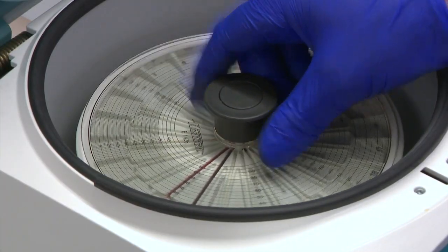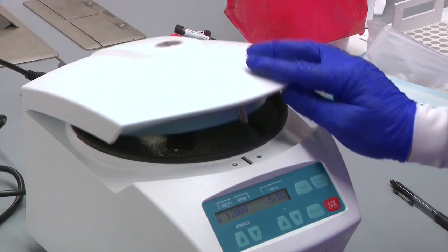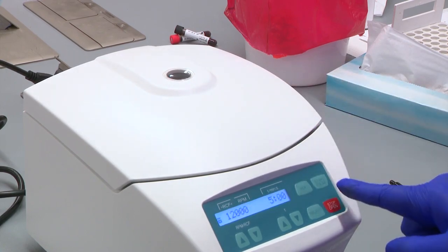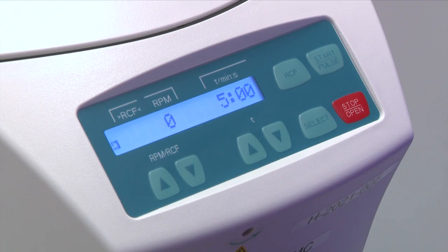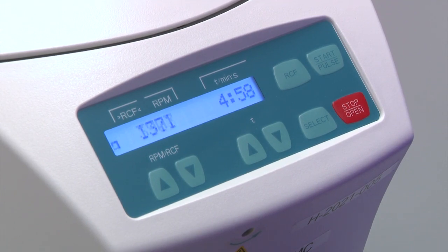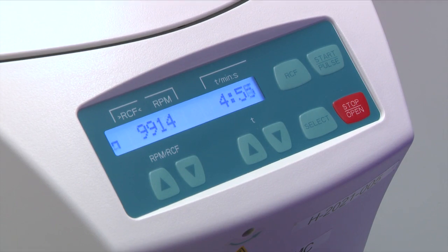Secure the centrifuge lid by pressing down until it clicks in place and close the centrifuge. Centrifuge tubes for five minutes at approximately 12,000 rpm. Do not adjust the centrifuge speed or time as this has been validated for each individual hematocrit centrifuge.